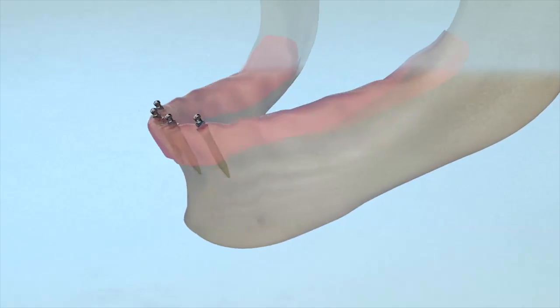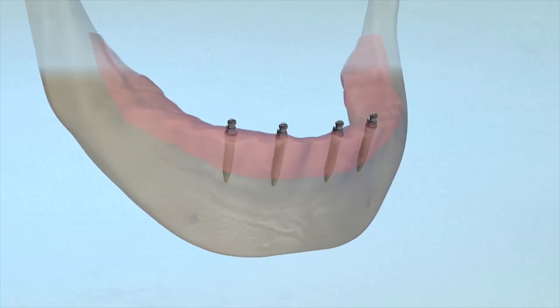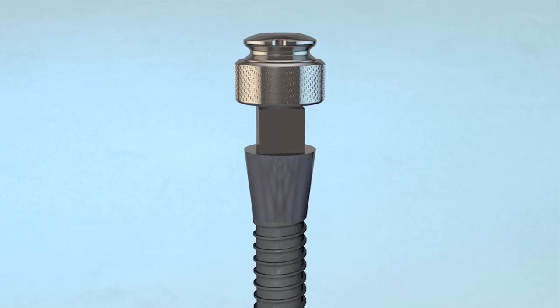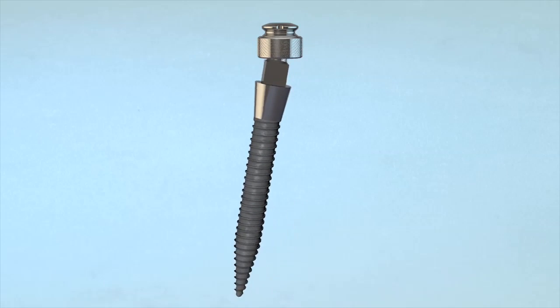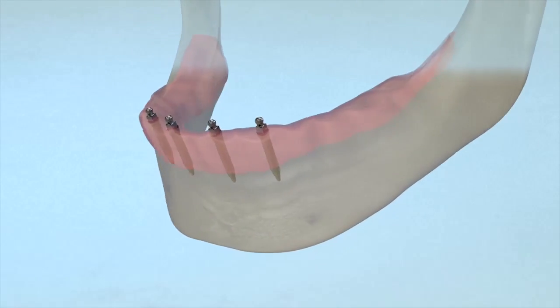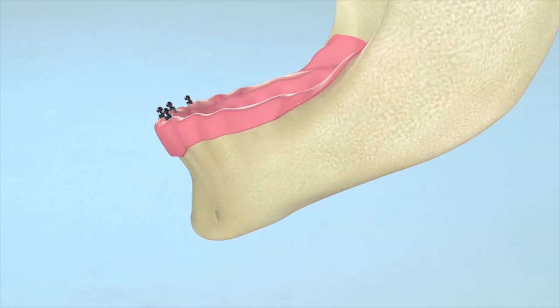Align the implants as parallel as possible. The O-ring denture fixation system allows up to a 30-degree range of diagonal connection; however, the straighter the implants are to each other, the better the connection and fit.